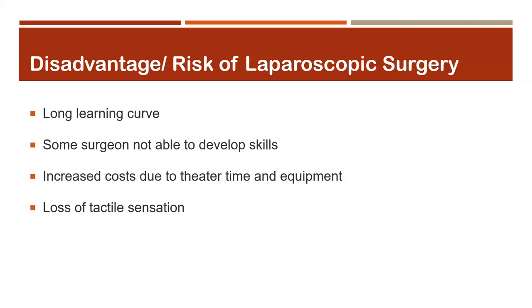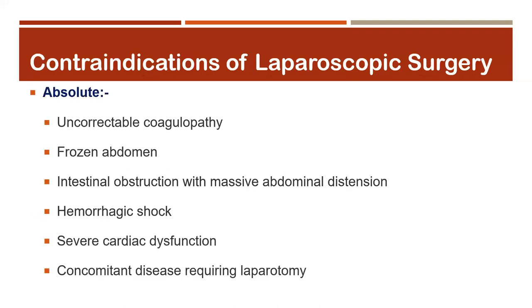We hold the tissue, we touch the tissue, and then we differentiate the tissue, the perception of the tissue by touch. But in laparoscopic surgery, this is lost gradually. So there are some other contraindications of laparoscopic surgery. There are some absolute ones, as in general surgical procedures.